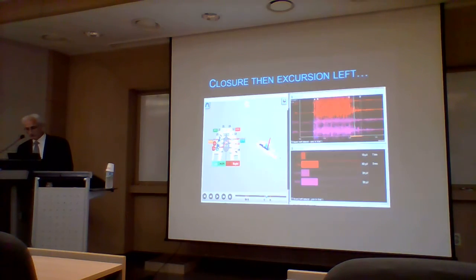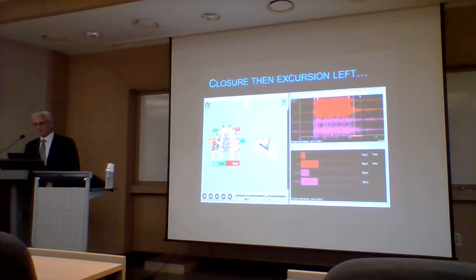And when we use the companion EMG, we can see that when the patient moves left, there's high muscle firing. So that occurs here to the right of this line. In this recording, the patient is holding their teeth together here, and then they slide left here. When they slide left, you see muscle firing between C and D. That's where the implants are under frictional stress.